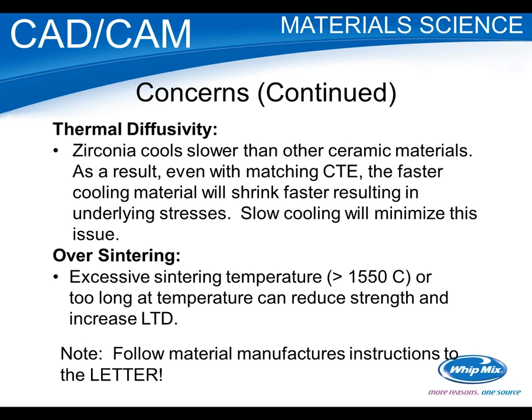And all in all, again, this is a new material. It's not going to behave like porcelain or what you're familiar with. And so I strongly suggest following the manufacturer's instructions. They've been working with this material for a long time. They should have addressed all of the issues. And again, it's not like what you're used to. So do your homework and be prepared, and you'll minimize your problems.